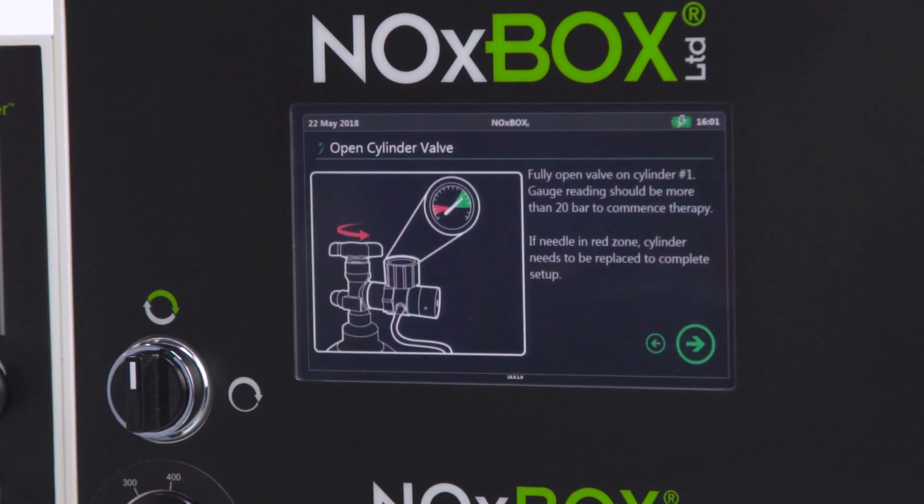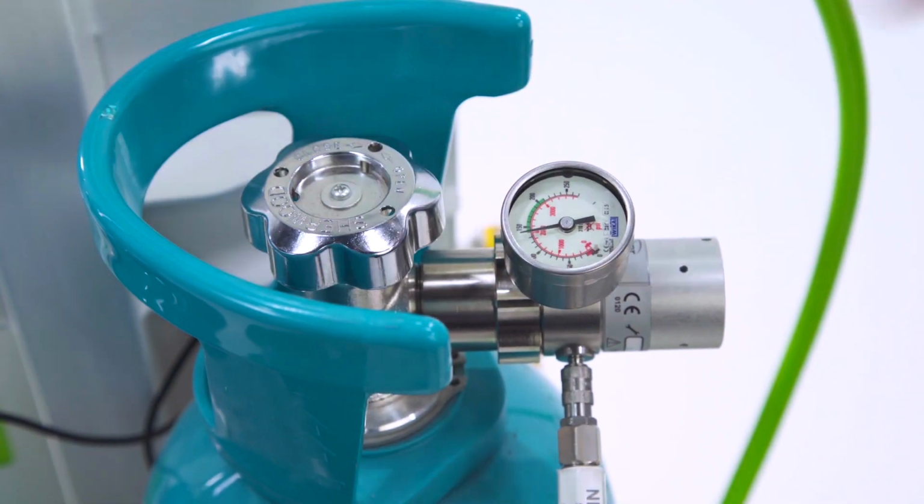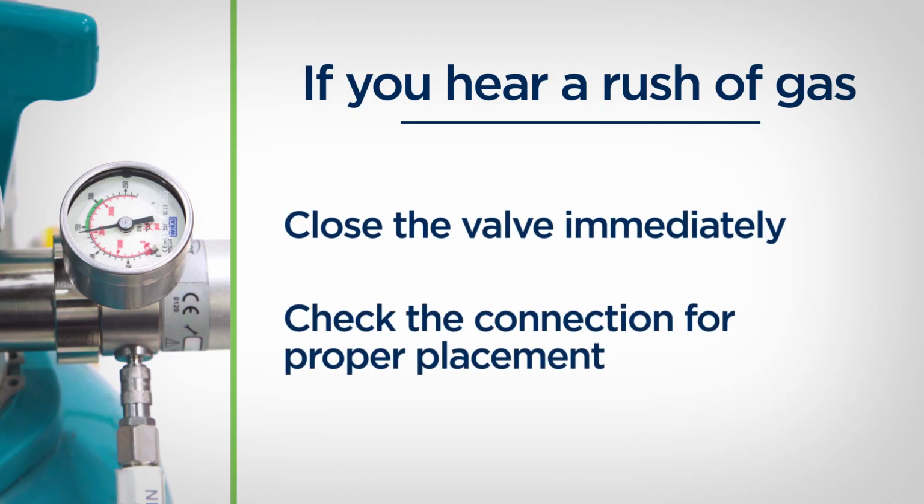Now, open the cylinder valve slowly. If you hear a sudden rush of gas or a leak, close the valve immediately. Check the connection for proper placement.